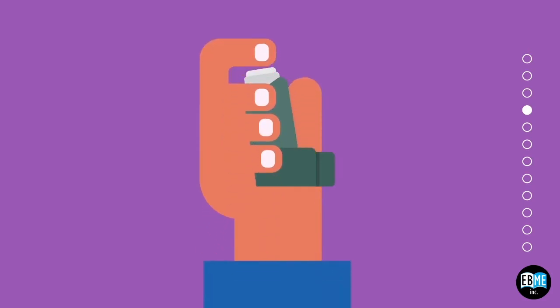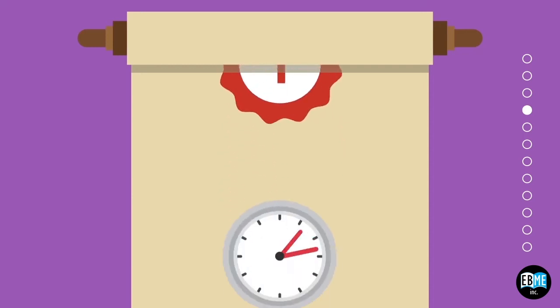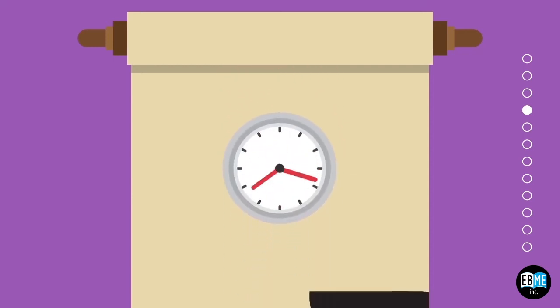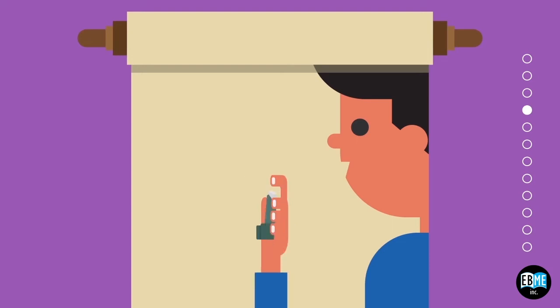Hold your MDI with your index finger on the top of the canister and your thumb under the canister holder, called the boot. If you are using the MDI for the first time or you haven't used it within 48 hours, prime your medicine. You can do this by turning the mouthpiece away from you and spraying once or as many times as recommended, found in your medication instruction insert.